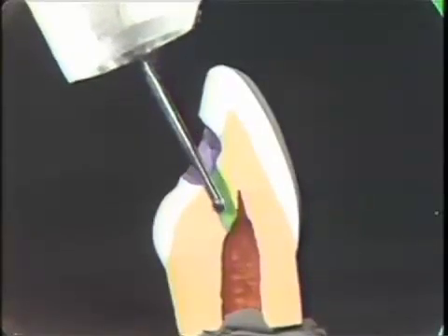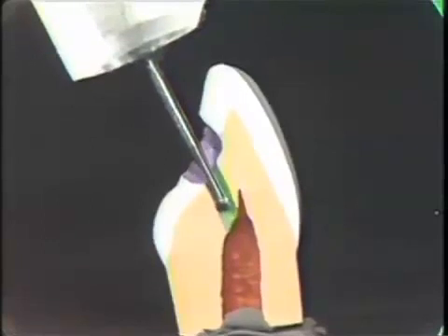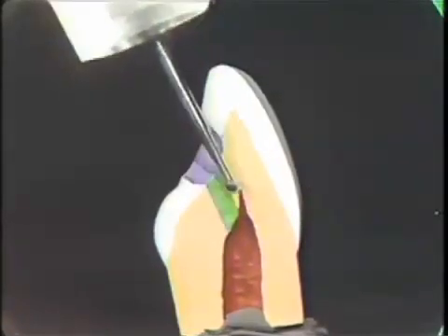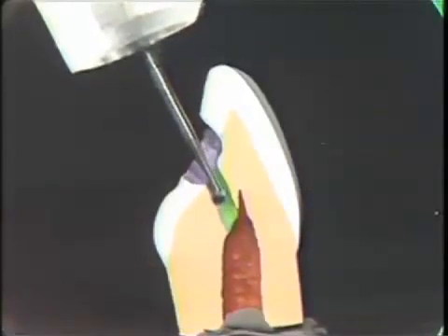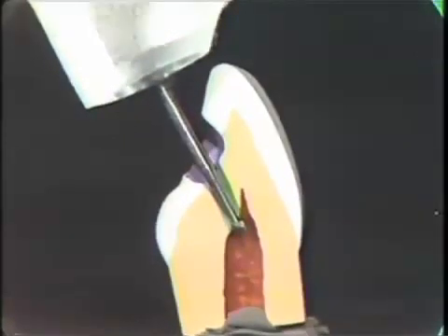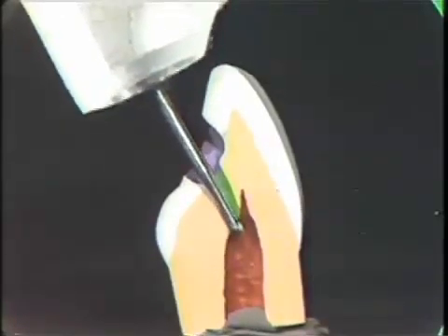The second way you might get into trouble is if you're in the proper angulation and you get part of the way to the pulp and you get kind of nervous and you feel like you've gone too far, so there's a tendency to start to drill around in this area looking for the pulp. Now, you never want to do this, because if you find the pulp, it'll just be by accident. The only way to find the pulp is to really know where it is and go directly to it. Once again, you'll feel the burr fall into the pulp chamber as there's a sudden reduction to the drilling pressure as you enter the pulp.